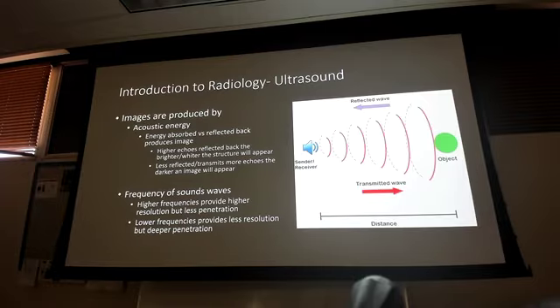And you'll play with those knobs in your EFAST depending on how far you gotta go and how big the patient is. Most everybody here is pretty healthy, so you'll probably all have the same settings. But when you're out there doing your EFAST exam, I promise you, the frequencies that you're gonna set on your knob are gonna be much different for the 150-pound trauma patient compared to the 425-pound trauma patient, because you have a lot more tissue to get through, right?